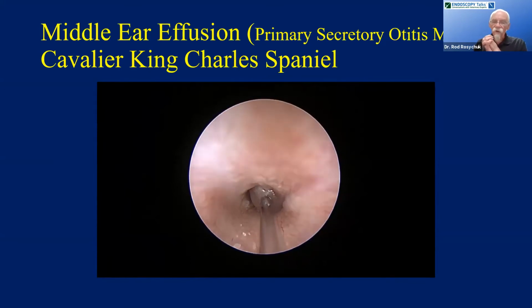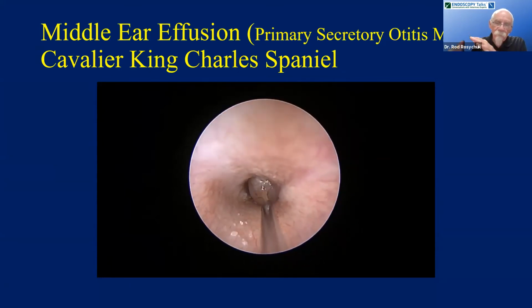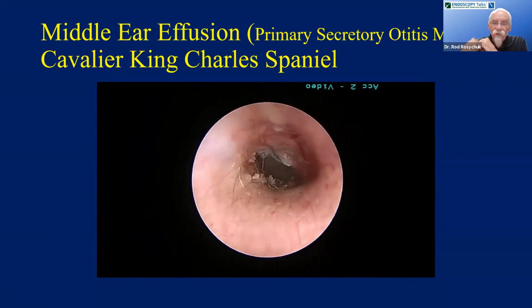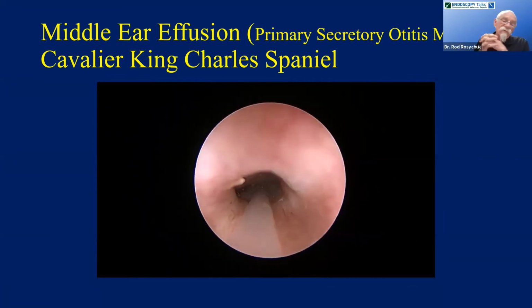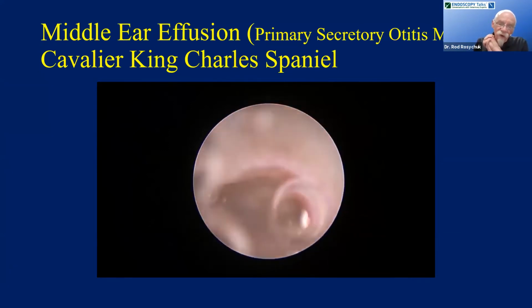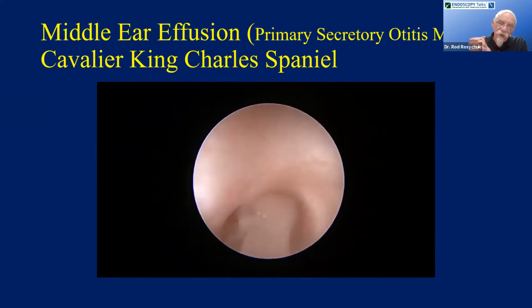A catheter doesn't make a hole in your dilated pars flaccida very well. If you have an issue sucking that out, I just squeeze the stuff out. And then we drop our catheter in caudal ventrally again, create our hole, and essentially flush that mucoid material out of the middle ear.